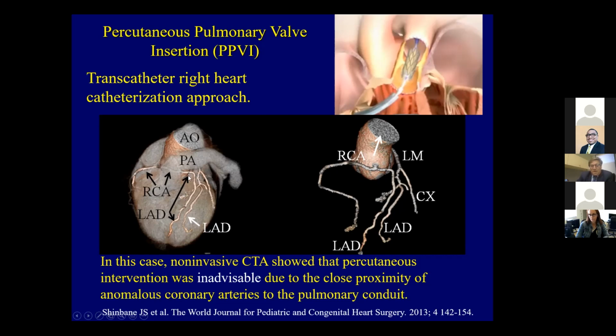There was a lot of calcified wall right next to these coronary arteries that they had to remove en bloc. So again, for this lecture, the importance is that by having the patient's actual three-dimensional anatomy, using their CT as an avatar, a very risky procedure was avoided and a correct procedure was done, using a non-invasive study initially to guide it.